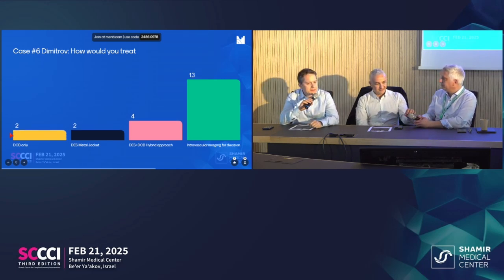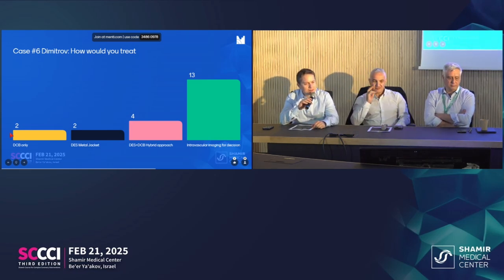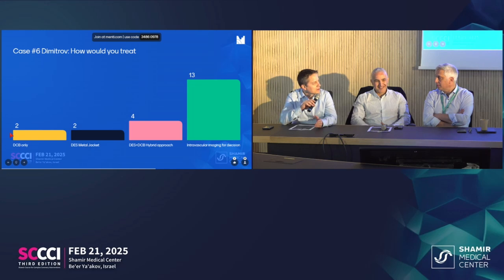Well, I think, first of all, you see most of the audience opted for the intravascular imaging. I think in these conferences, it's always the right answer. But in real life, there's the dissection. There's an artery that you need to treat. Whether DES only or DES with DCB, that's an open question.